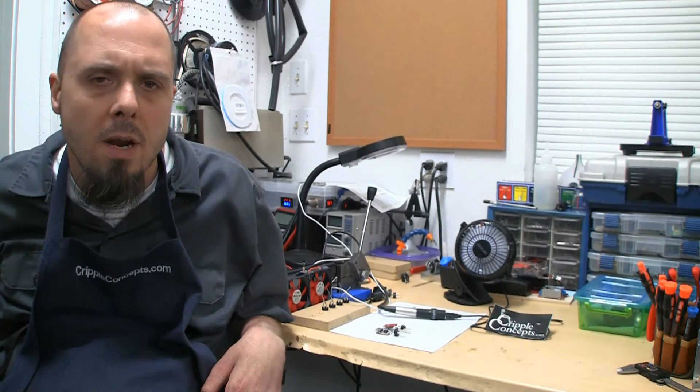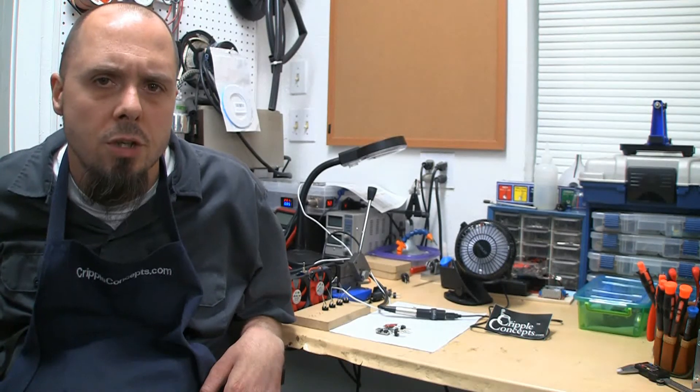Hey everybody, just coming with a quick update on the USB chargers for wheelchairs this week.